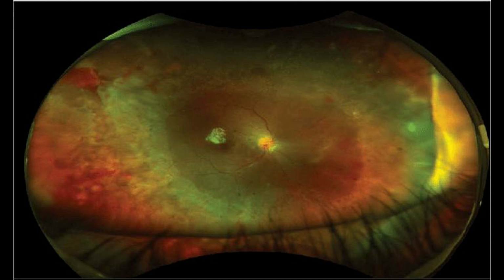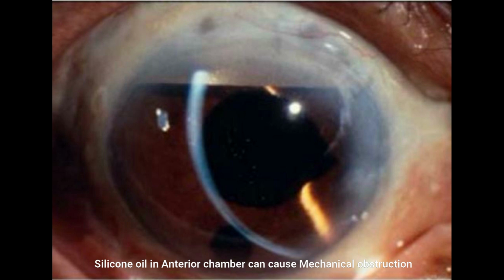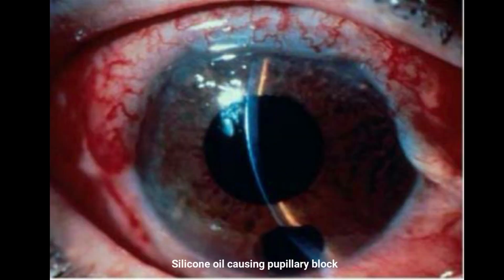Silicone oil overfill can cause silicone oil induced glaucomas. Silicone oil can cause mechanical obstruction when it is completely filling the anterior chamber. In this slit lamp photograph, we can see there is silicone oil inside the anterior chamber which is causing pupillary block, that is, closed angle glaucoma.